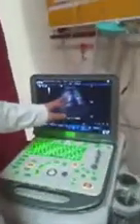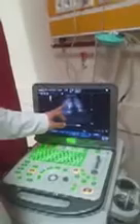to see the space between the kidney and the spleen, and I'm trying to pick up the free fluid between the spleen and the left kidney.